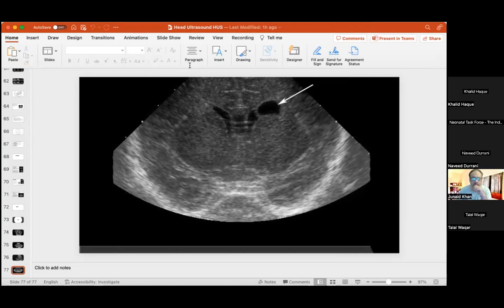It depends. If you have found a lesion, for example periventricular cystic areas, there are limitations in ultrasound. In order to get the detailed anatomy, it is recommended to do an MRI. But again, if someone is in a low income country, the MRI might not help you in future when you already see the cystic structures on the ultrasound.